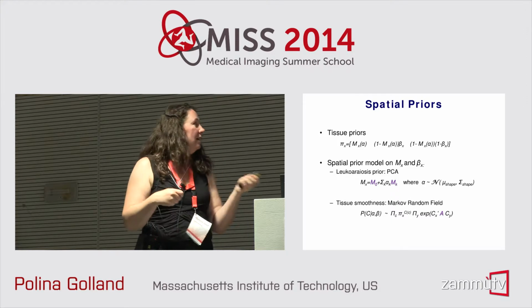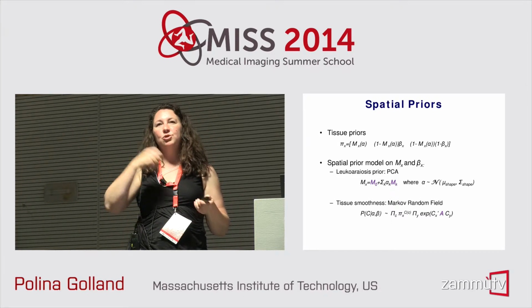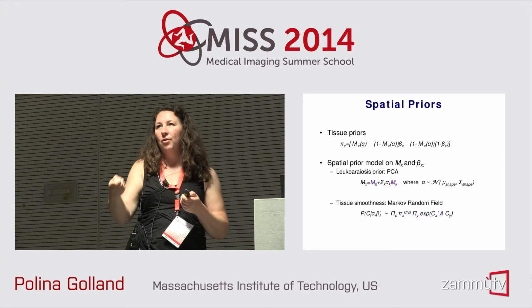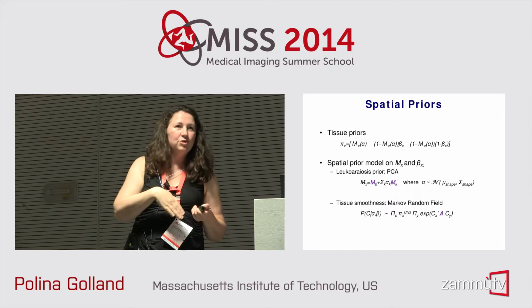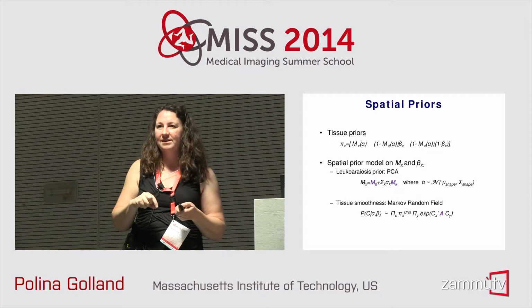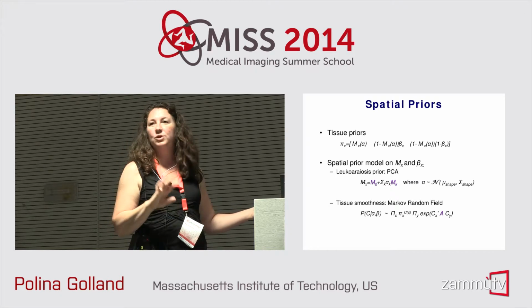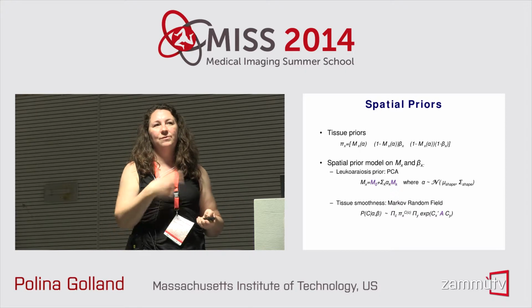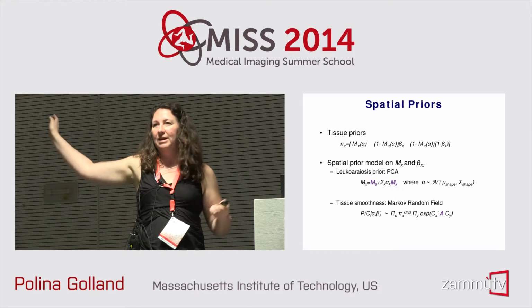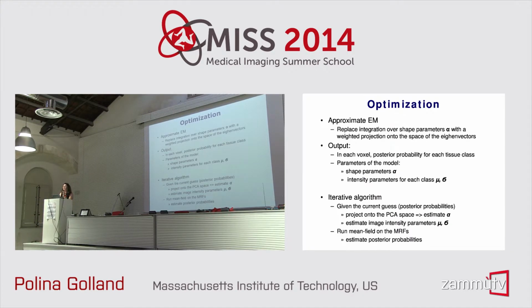And so what we do here is we penalize neighboring stroke to leukoaraiosis much more than healthy tissue with stroke or leukoaraiosis. And those are much more than being the same value. So this A is also a parameter of the algorithm, which we don't try to estimate, we just play with it until it works. And so we played with it in 3 images and then applied it to 200 without changing the parameter. Okay, so once we have this model, we need to optimize.